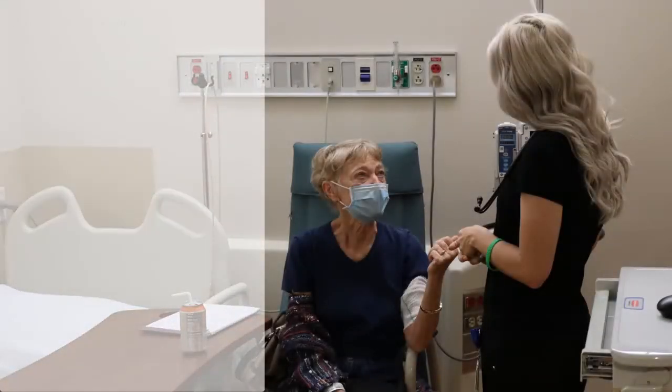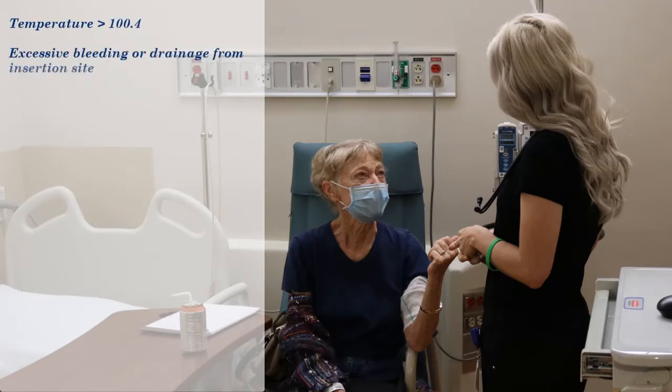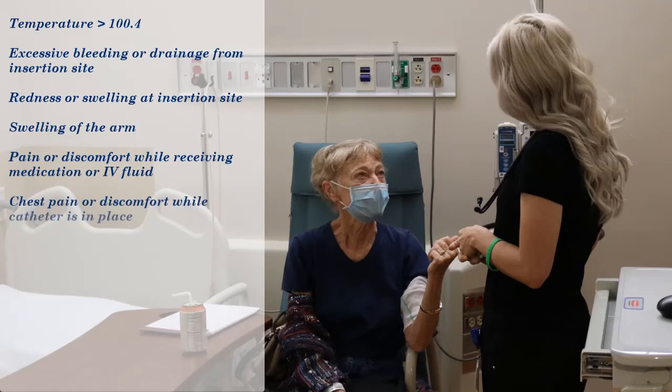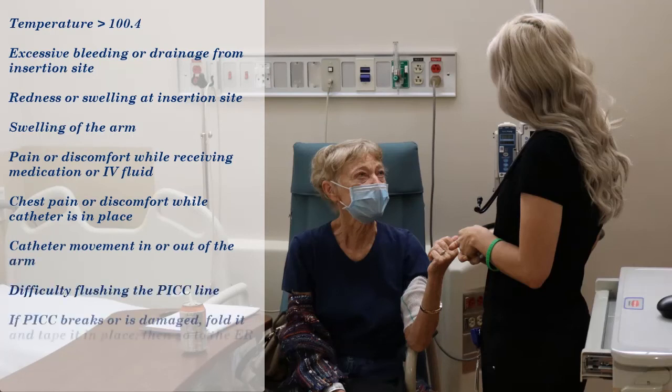Although uncommon, complications can occur with your PICC. These can include a temperature greater than 100.4, excessive bleeding or drainage from the insertion site, redness or swelling at the insertion site, swelling of the arm, pain or discomfort while receiving your medication or IV fluid, chest pain or discomfort while the catheter is in place, catheter movement either in or out of the arm, or difficulty flushing the PICC line.